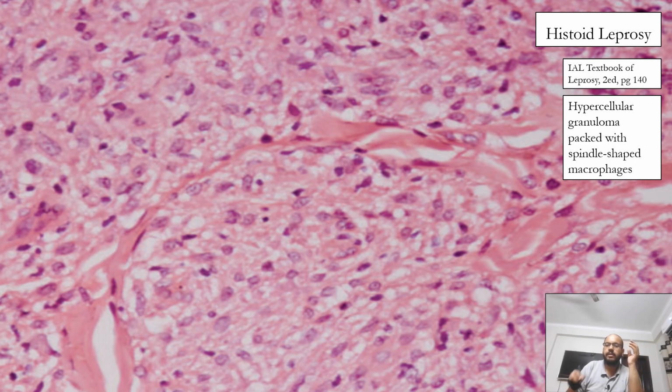So in histoid leprosy, we will not spend much time. It is a hypercellular granuloma. That means a lot of cells are there in the granuloma and they are densely packed with spindle-shaped macrophages. Now on H&E, it is very difficult to point out spindle-shaped macrophages. I would request you to look at the textbook or go to pathology outlines and look at articles for histoid leprosy, and you will easily be able to make out spindle-shaped macrophages.